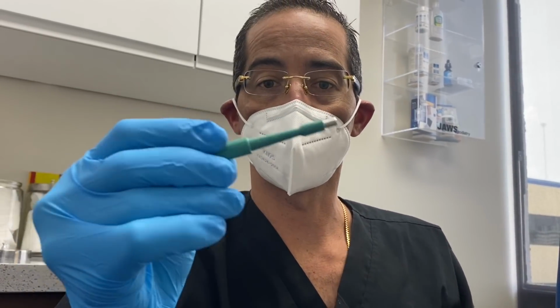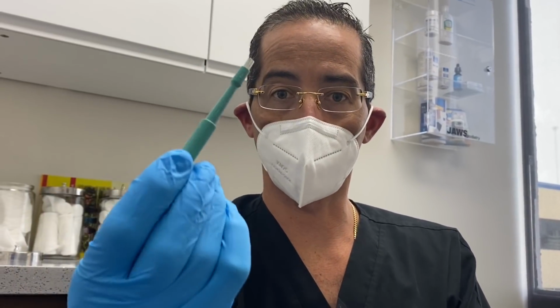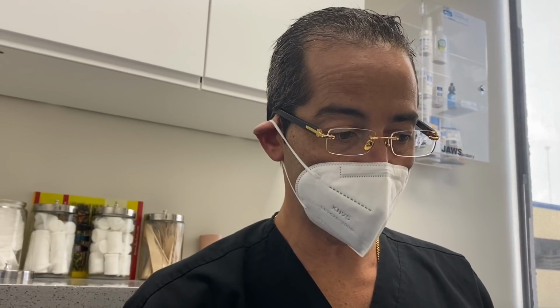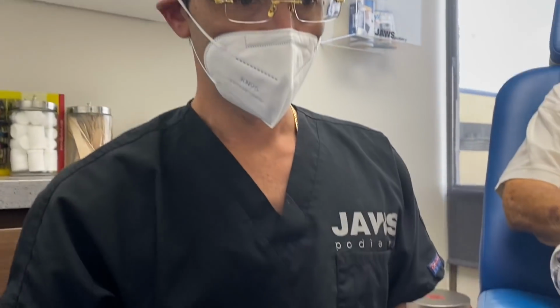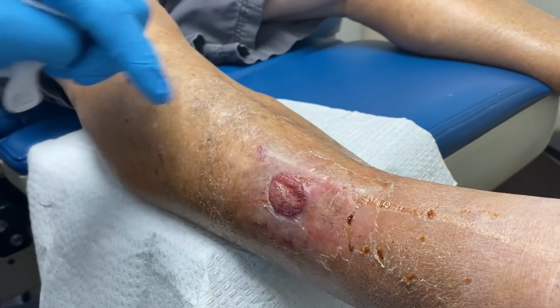So this is the tool that we use. We're going to do a 4 millimeter. There's 2, 3, 4. It's very important that when we perform these biopsies, it's not just pick a spot and just punch it, right? Because there are important neurovascular structures, number 1, and number 2, we have the fibula and we have the tibia. We have to find a good spot, especially in this area. So the tibia is right here. The fibula is right here.